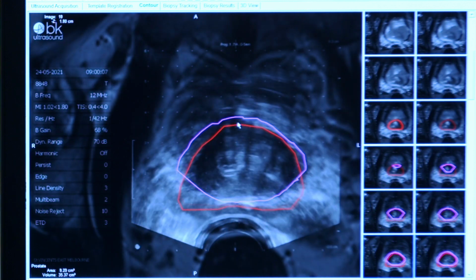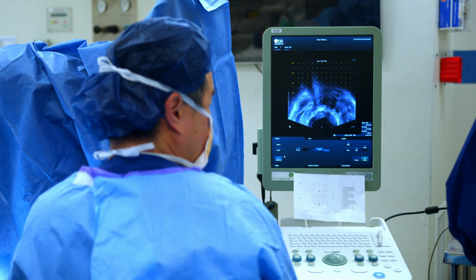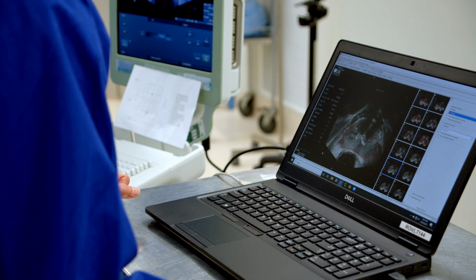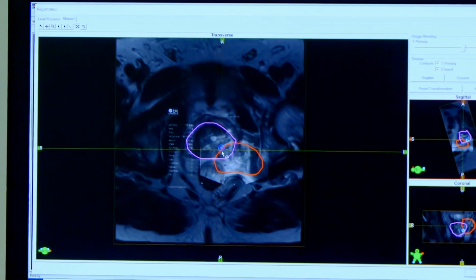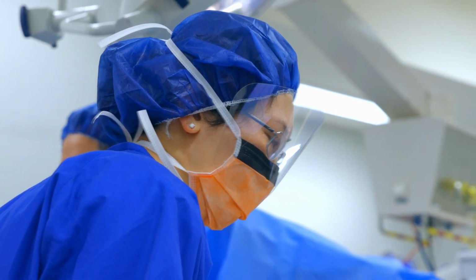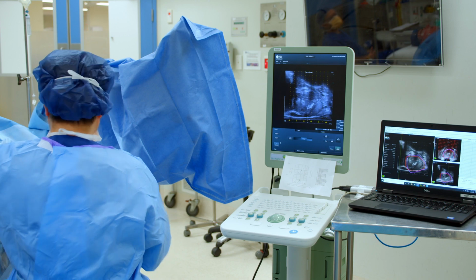There we go. To try and better target these abnormalities seen on the pre-biopsy imaging, the method we're going to demonstrate today is called a software fusion, where we use computer software to import the MRI images into the computer before the biopsy. Huong is then able to map out the MRI images and the abnormality on the MRI. And the computer then will be able to show us on the ultrasound where to target the abnormality.